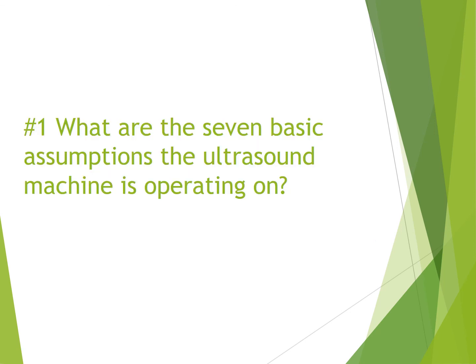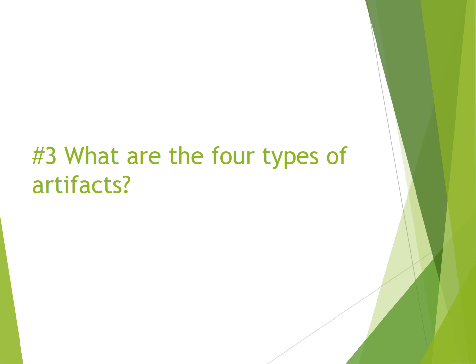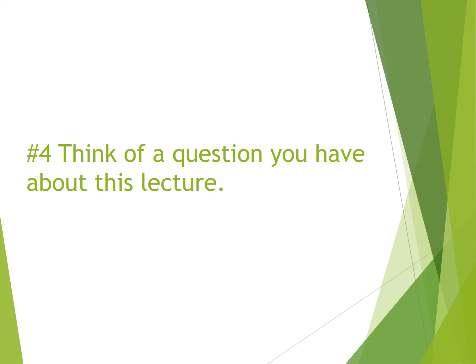Number 1, what are the 7 basic assumptions the ultrasound machine is operating on? Number 2, explain interpreter and operator error. Number 3, what are the 4 types of artifacts? And number 4, I want you to think of a question you have about this lecture. If you really can't think of any questions, everything makes sense, then think of a test question that you know you would get right. Sometimes being able to teach the subject helps to solidify your understanding of the subject.